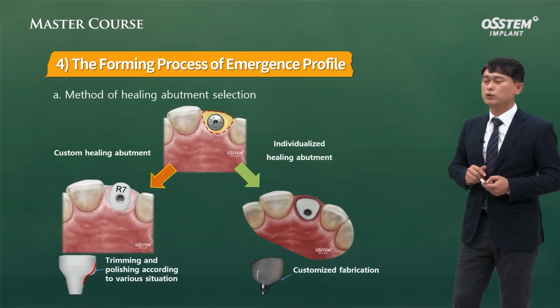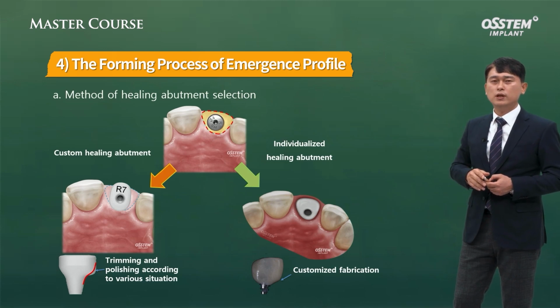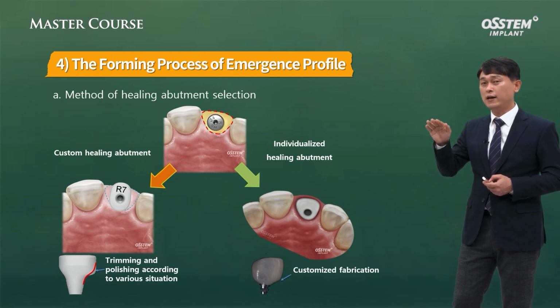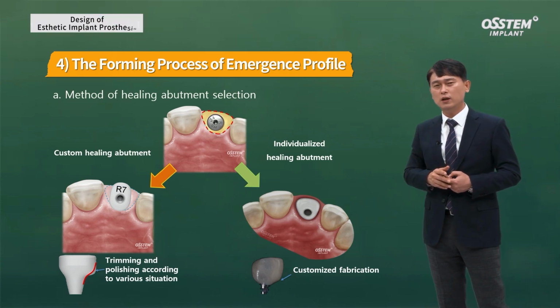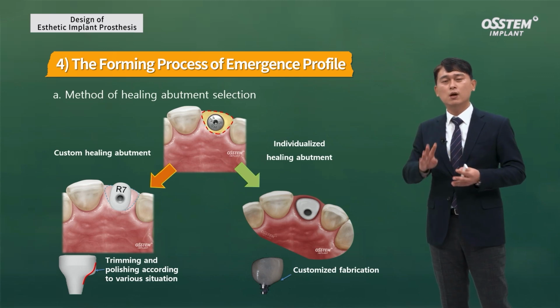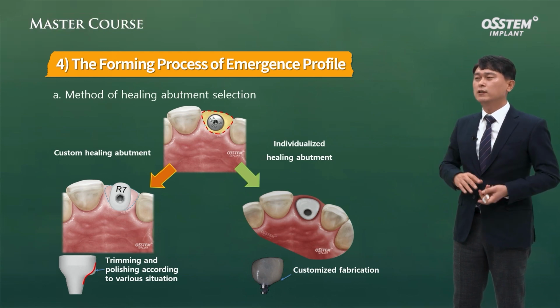This is the upper central incisor at the top picture. A perfectly round healing abutment is used here, which is totally different from the shape of the final maxillary anterior shape. So molding the shape would take a long time. A temporary should be used for a long time, and it should be adjusted every week to slowly open up the gingiva. It may require more than 4 steps.